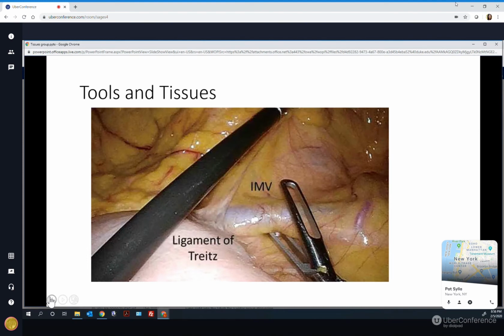If I show them this image without any annotation, they should be able to recognize not only exactly what the structures are in this field, but also what the next steps should be and what the procedure is. We have typical anatomical landmark moments, just like for the gallbladder when you have the triangle of Calot exposed. This is one of those typical steps in a left colectomy that you would know corresponds to that particular step.